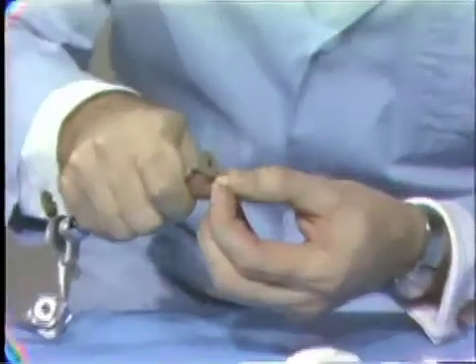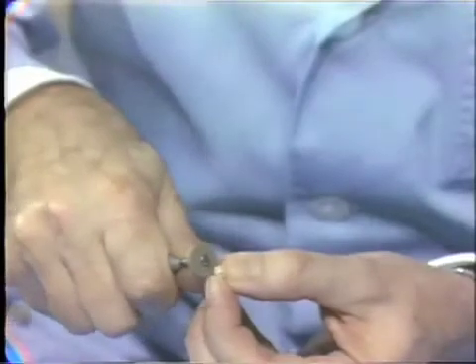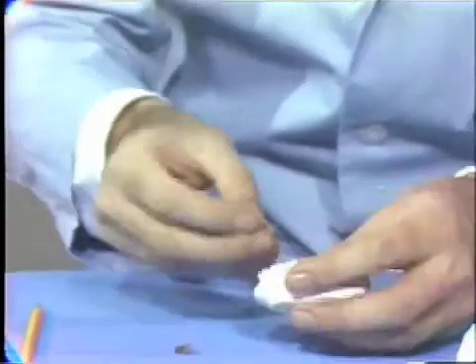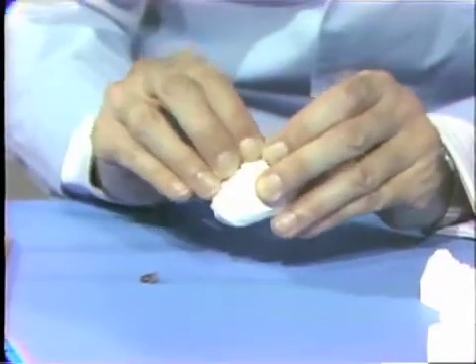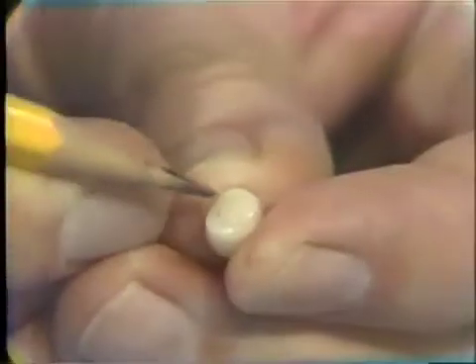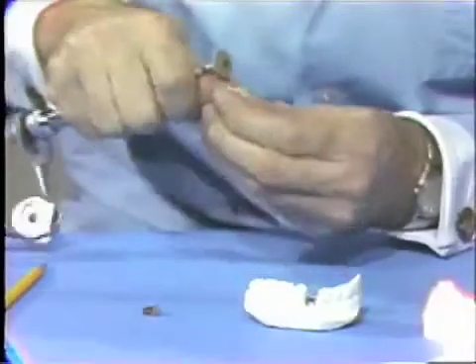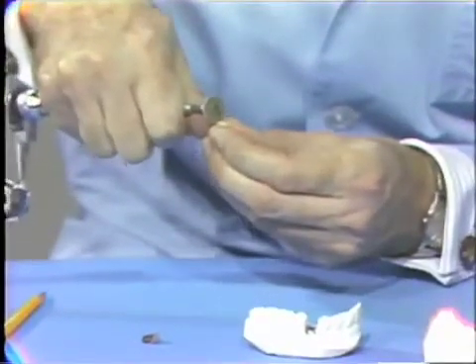Now here is the marked area which is being ground off, and then return the facing back again to the model, press it down into the desired position, remove it again, and now you'll see that we've got a marking in a somewhat different area. We've removed from there, so it's hitting on this other area. So now we take our grinding point again and grind off.